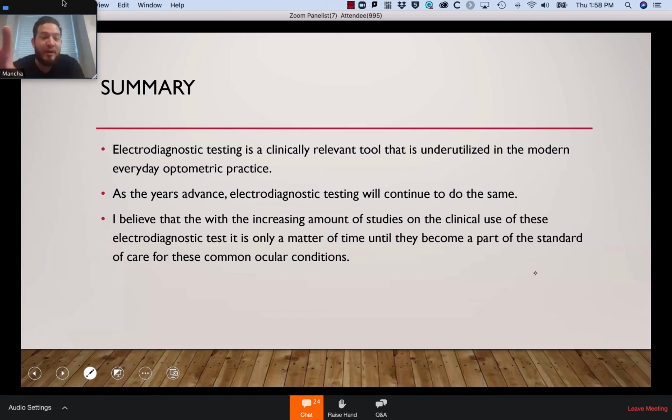I think it's torture, because most of the patients we're using for the visual field are these geriatric patients, right? And so they're already falling asleep, and we tell them, come back again. It's not reliable, come back again. And it's hard for them. Or I am a huge fan of objective testing over subjective testing, right?